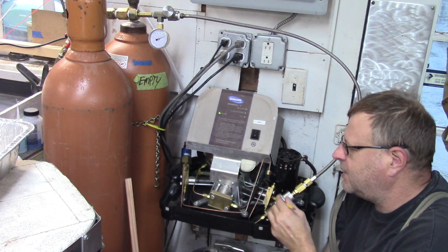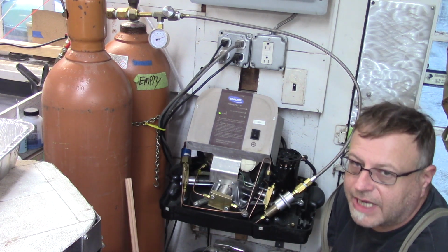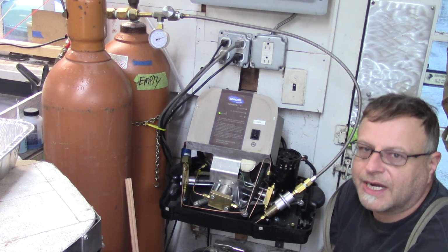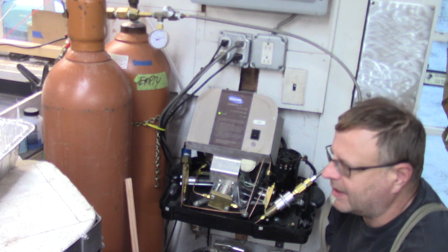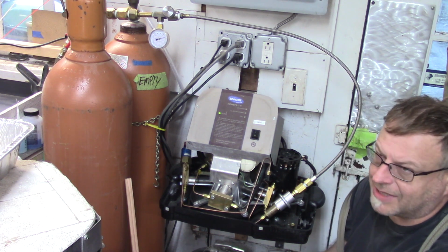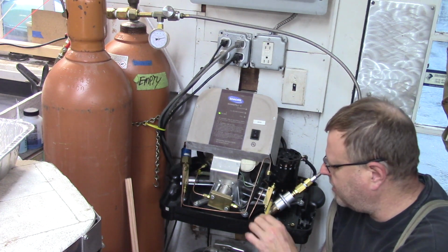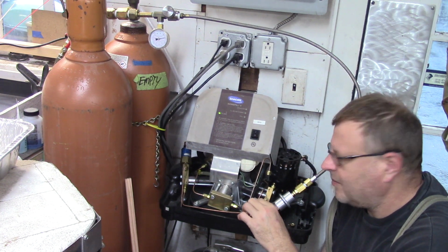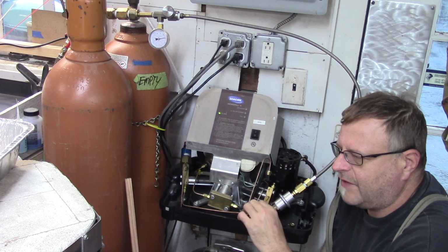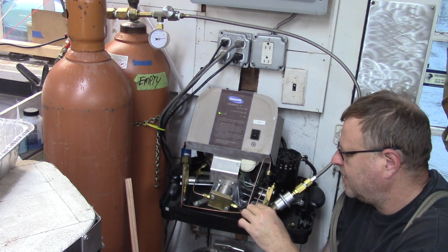So these are basically just like taking a spark plug out of a V8, taking 4 spark plugs out of a V8 engine. The thing cranks over a lot easier because it's not building whatever the amount of compression. It's 160 psi or 180 psi per cylinder. It's not doing that now. In this case, it would be 1500 and then 2000. So whatever between.